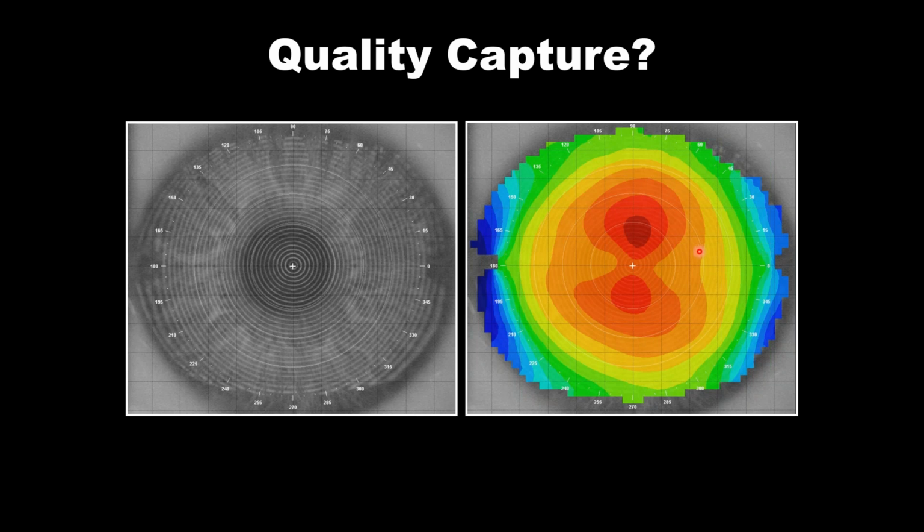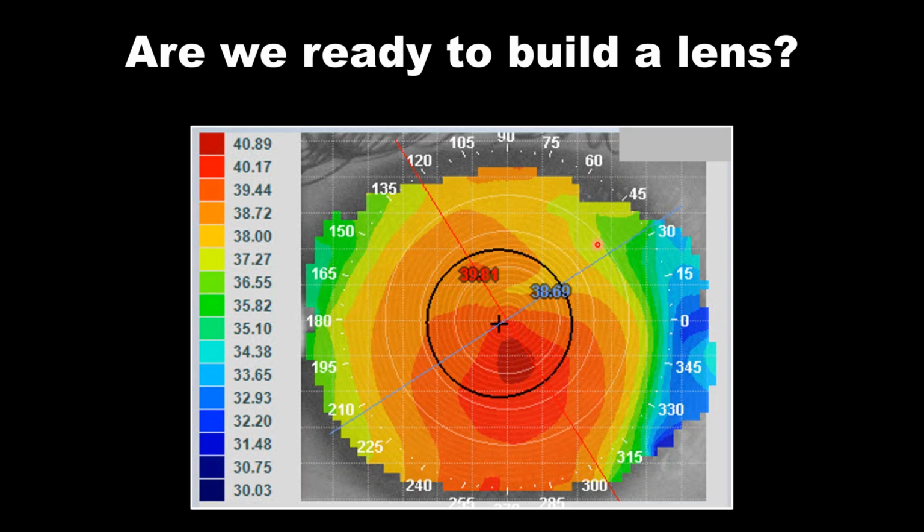We should see all of these contours looking well-rounded. If we see a sudden red spot next to a cold spot or a steep next to a flat, that's not very normal in a healthy, normal eye. So that tells you there could be topographical error. But here we're seeing smooth, well-rounded contours. I'm feeling pretty confident.